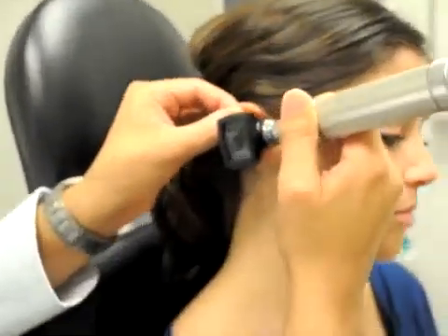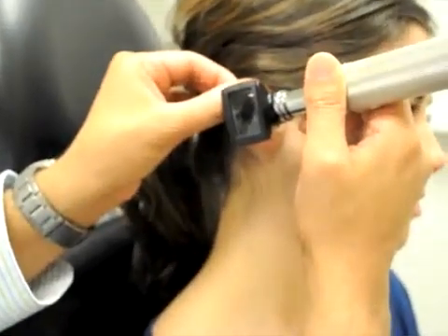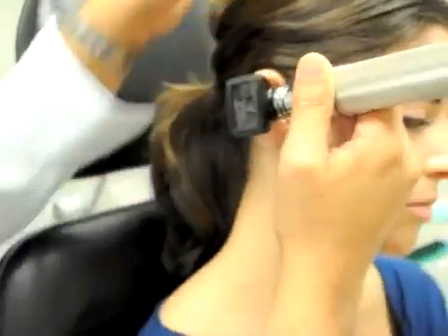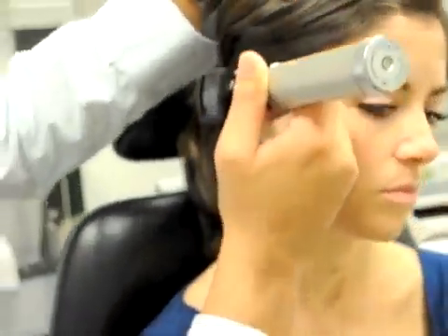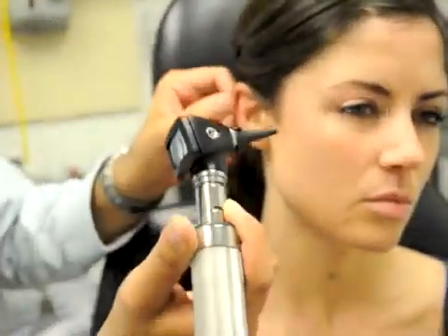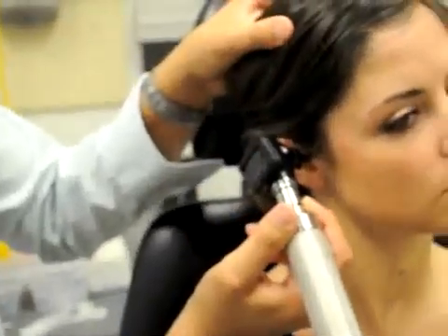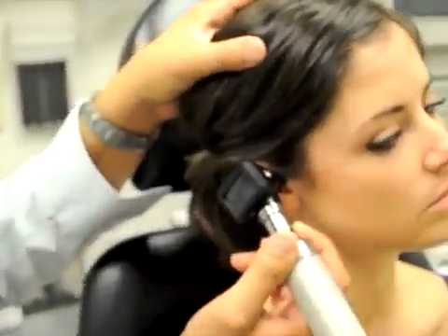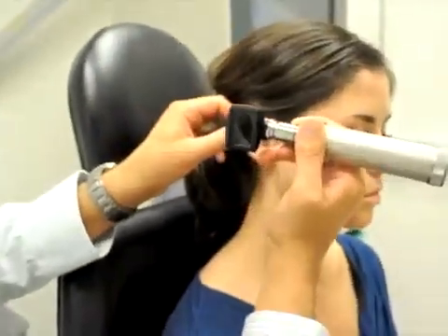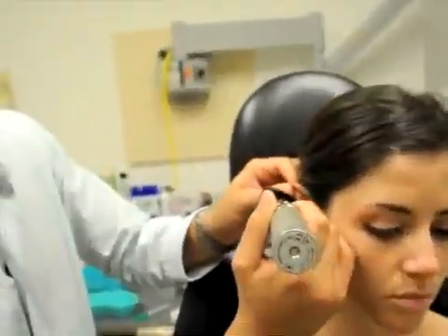The importance of this type of physical examination or formation of my hands is that if Brittany were a small child and if she moved her head, my otoscope would move with her. If I was not resting my hand on Brittany's cheek and she was a little child, she would move her head and the otoscope would injure her external auditory canal. This is why it's important to rest your hand that's holding the otoscope on your patient's cheek and then insert the otoscope.